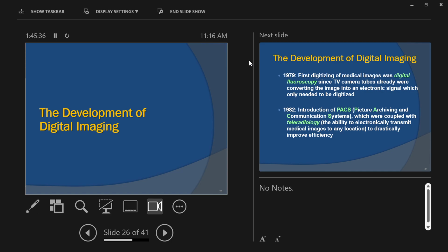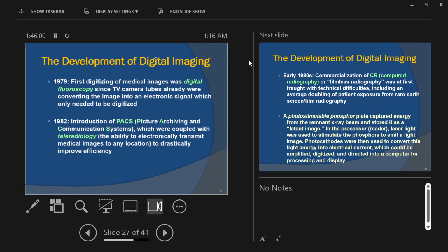With digital imaging, we can still create hard copy images. We can actually, in some cases, make hard copy X-rays that look just like the film X-rays that we used to take. There are ways to make an analog a digital image and have it printed out. But anyways, what we mean by digital is viewed, stored, displayed, transmitted, all of that on a computer. So let's go ahead and tell the story here.